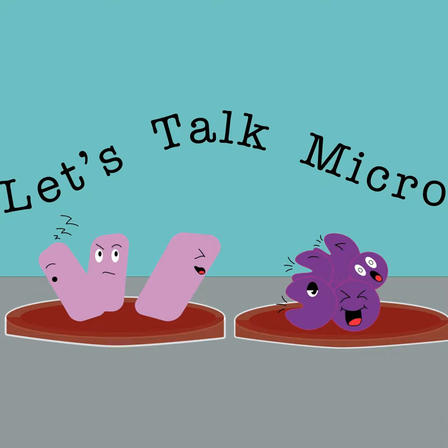Besides that, we use a lot of reference laboratories for mycobacteria. For microbiology, they're probably familiar with the GenProbe. The GenProbe is this really old platform that was able to identify only a very few mycobacteria groups, like TB and MAC. The equipment was discontinued last year. So we went through the process to get a different approach for mycobacteria. It was one, developing a multiplex PCR panel, a whole LDT in-house, or take the approach of NGS. NGS gives us the opportunity to expand the capability of identification, being able to include bacteria and molds, and even to explore NGS in the near future for direct samples.